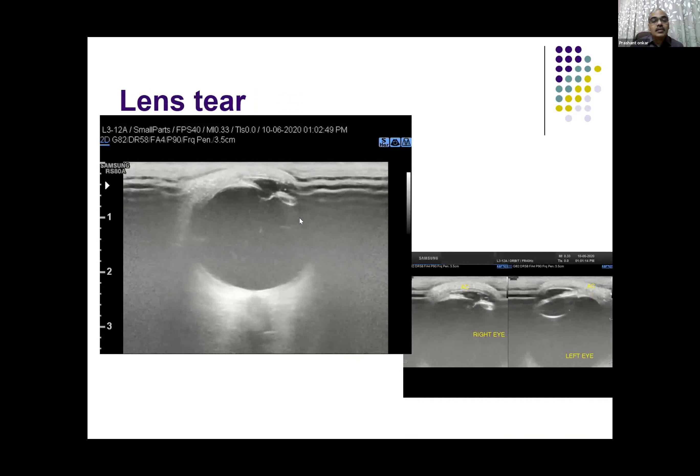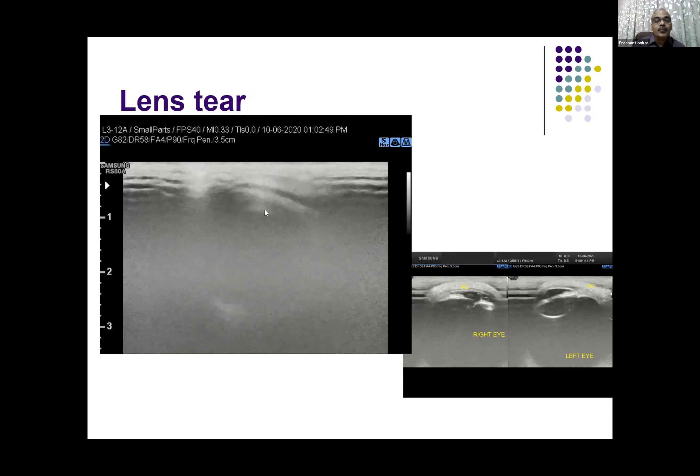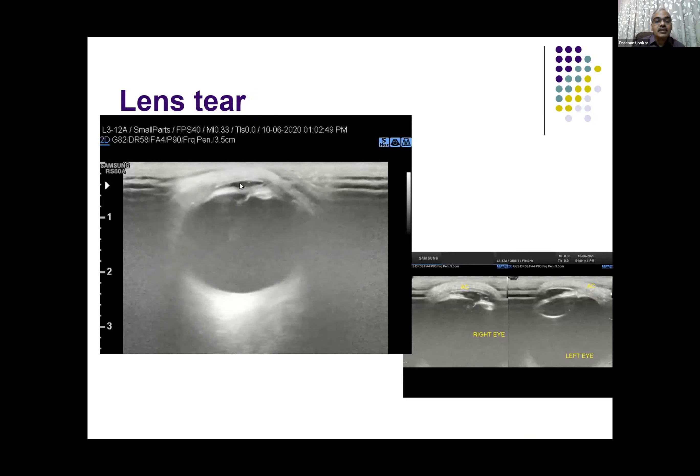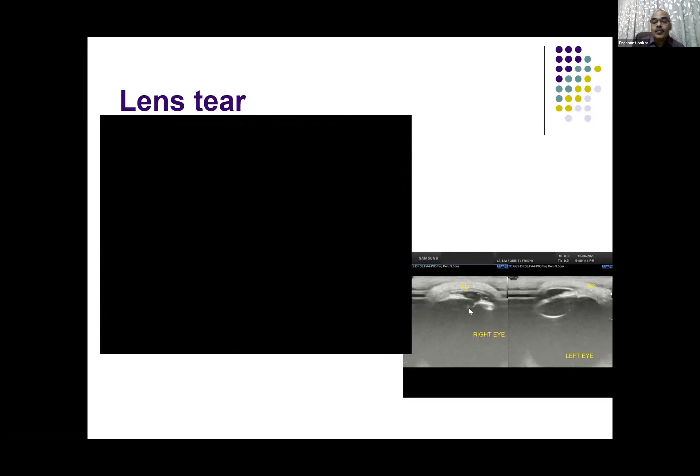This is another case of injury where the patient had an IOL inserted. But you can see that the anterior chamber is shallow here and there is a tear where the lens is attached. This is comparable to the other eye — the left eye shows normal anterior chamber and normal lens, while the right eye shows the tear in the lens.